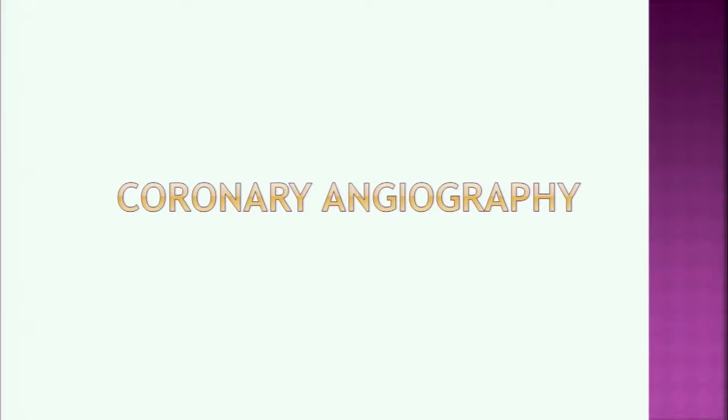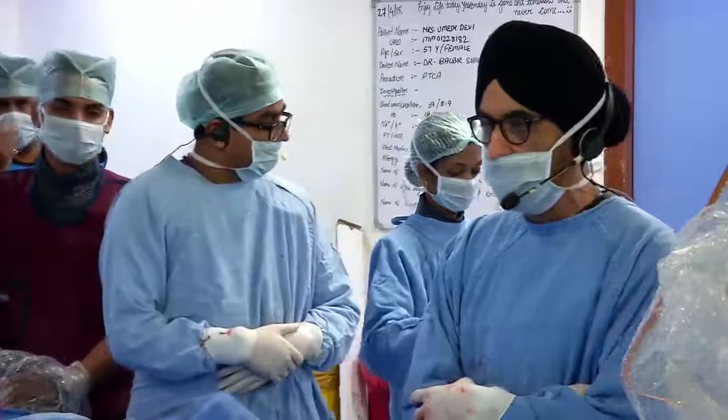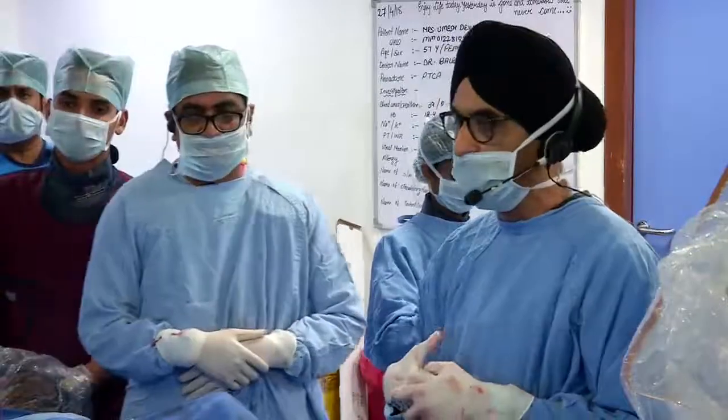There is no evidence of clear-cut infarction. The regional wall motion abnormality is not there. So we did the angio. We're going to show you the angio first.